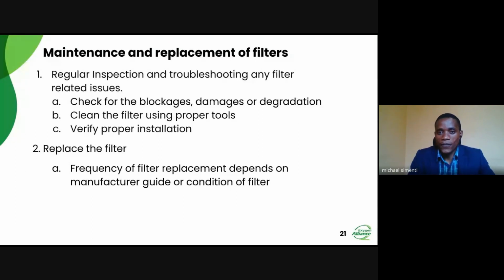So if it's a filter that you can't wash, you can't do anything otherwise, then the next step you can do is just to replace that. Replacement of the filter may also depend on the condition of the filter, as I have already said, or the manufacturer's guide. That's why I said it's more important, as engineers or as users, to take into consideration the guidelines from the manufacturer.